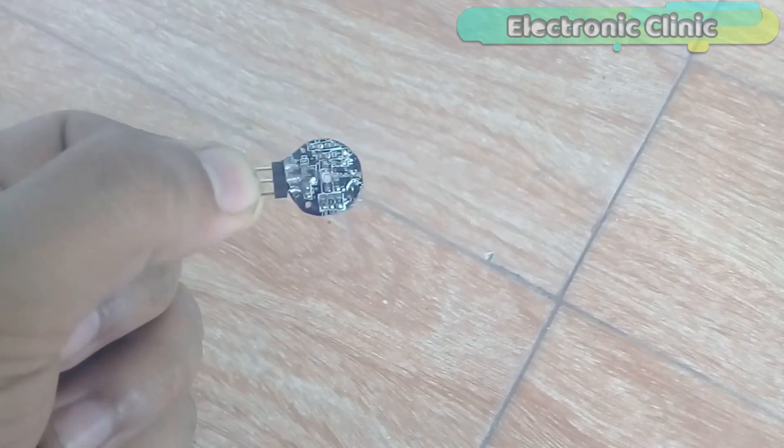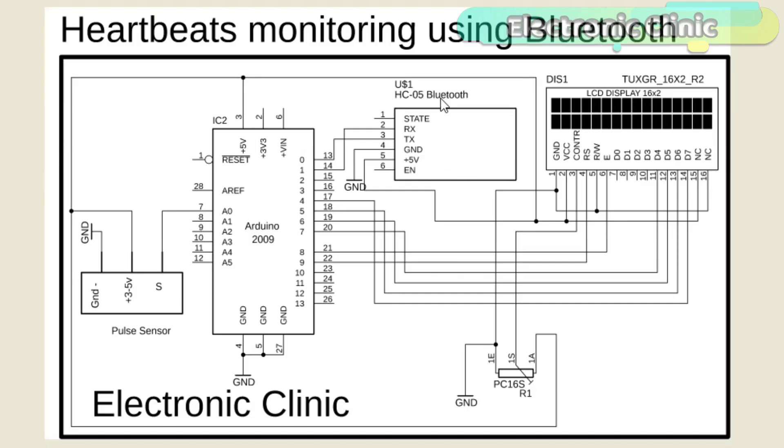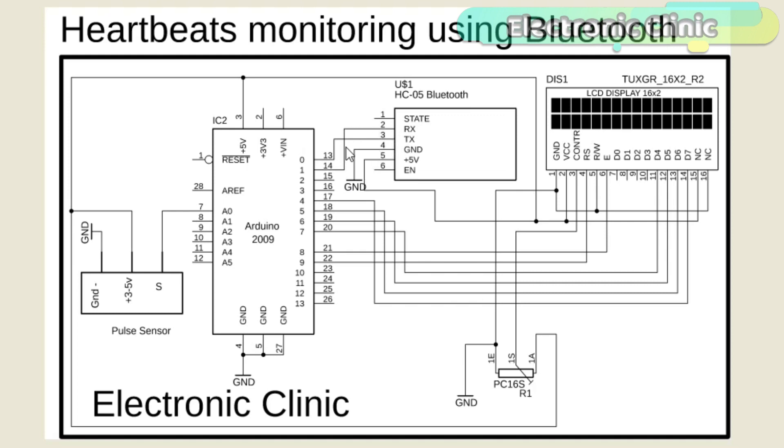The HC-05 Bluetooth module's 5V or VCC pin is connected with the VCC pin. The ground of the Bluetooth module is connected with the Arduino's ground. Connect RX of the Bluetooth module with pin number 1 of the Arduino and connect the TX of the Bluetooth module with pin number 0 of the Arduino.